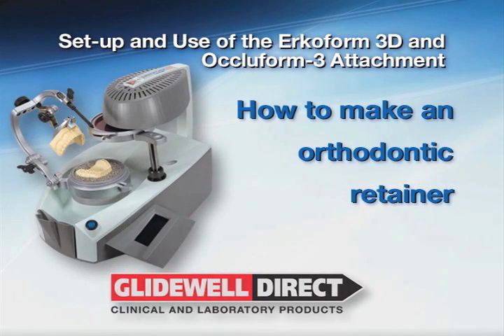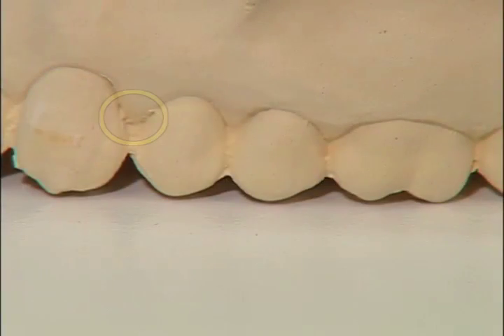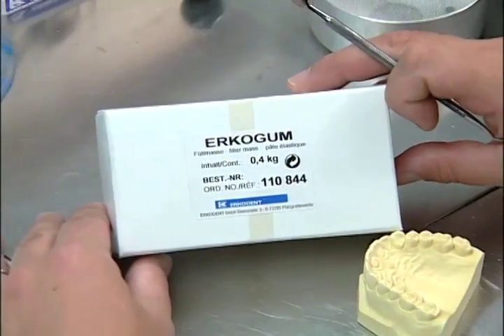How to make an orthodontic retainer. For fabrication of an orthodontic retainer, a ERKODUR 1.5 mm foil is used. Since this material is so thin, you will need to block out any undercuts and deep interproximal openings using ERKOGUM.